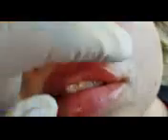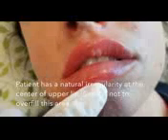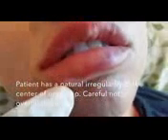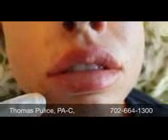You don't want to see a lot of bulk out here. You want to confine it to the pink-white border. And as you see, right there. And of course, this is swollen, but you see how nice and full they look. All the border is definitive, and they feel good. They don't feel hard as a rock. This is just swollen, and this will come down.